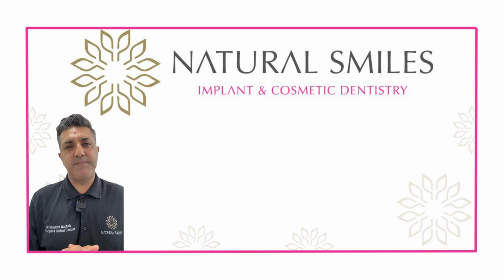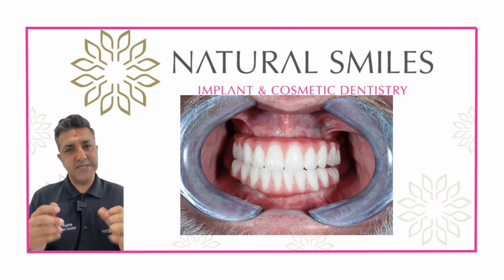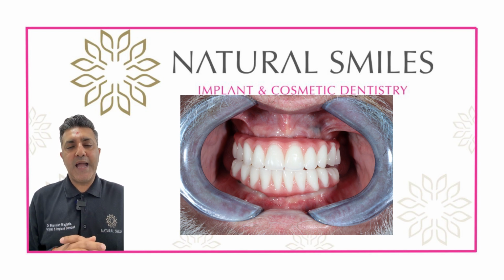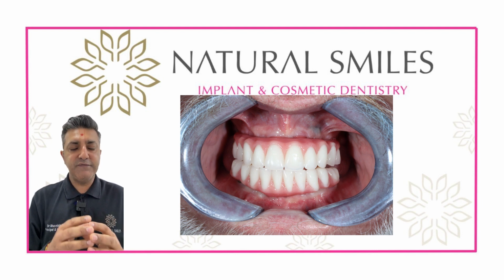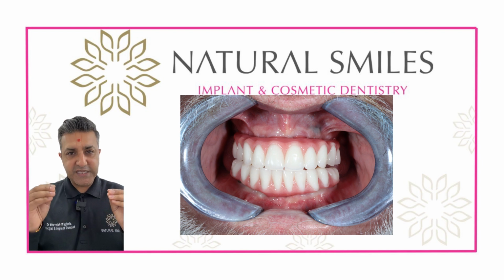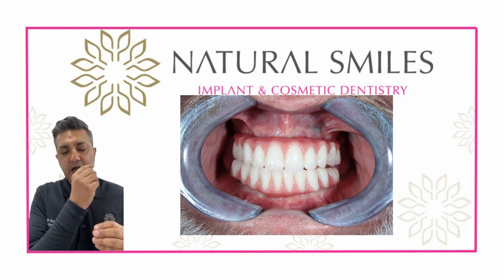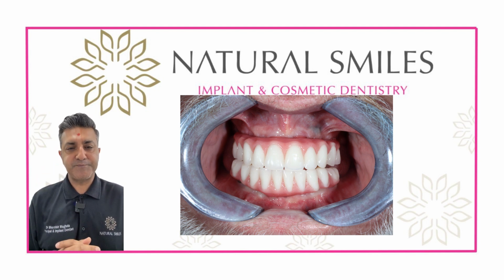One way is in patients who've had years of problems. They've usually lost some gum, they've usually got receded gums and a loss of bone associated with that. So in that scenario, we are going to use the dental implants to give a fixed set of teeth. And what we are replacing are obviously the teeth, but we're also replacing the gum. So we have a bridge which is screwed into the dental implants, and the false teeth that you'd have is going to replace the gum with artificial gum and the teeth with artificial teeth.